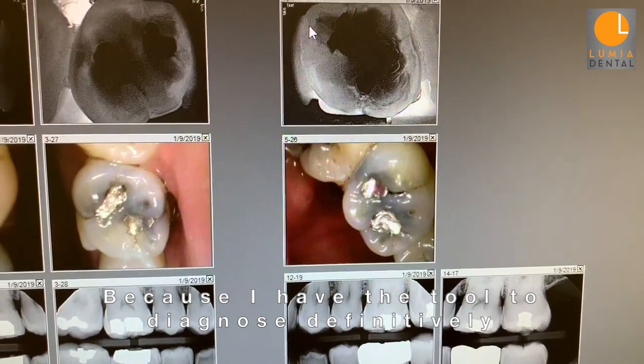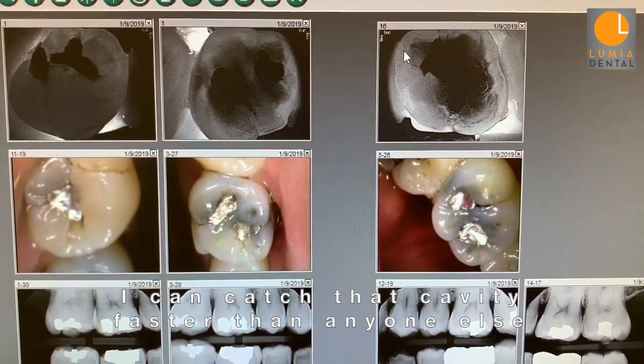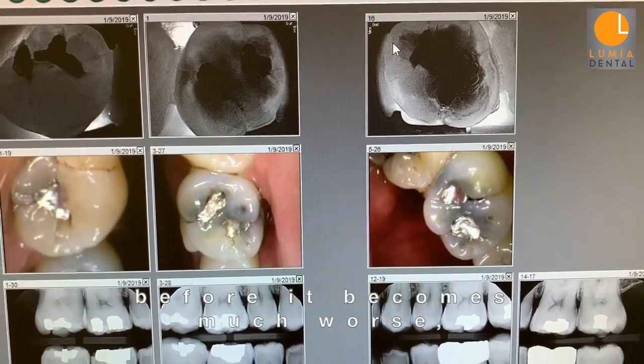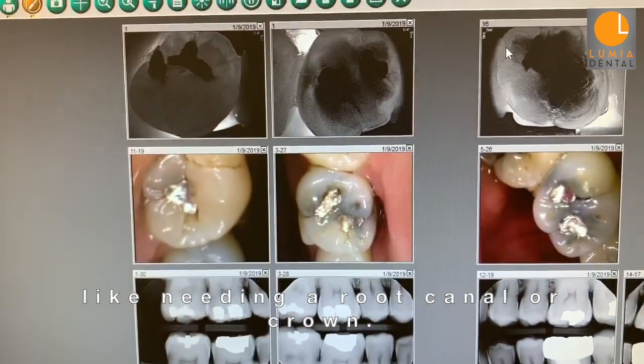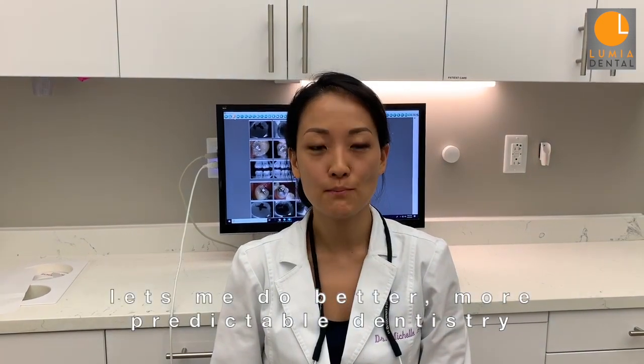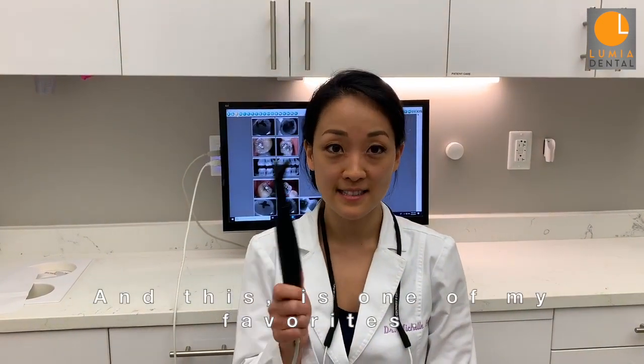Because I have the tool to diagnose definitively, I can catch this cavity faster than anyone else and treat it just by replacing that filling before it becomes much worse, like needing a crown or a root canal. All of the high-tech equipment we use here lets me do better, more predictable dentistry, and this is one of my favorites.